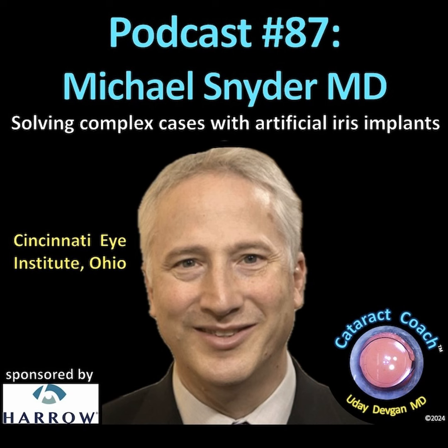And one of the other things that I'd love to get access to is some of the sulcus-based pseudophakic technologies, right? So there are actually some sulcus-based presbyopia correction options that are non-multifocal. Having access to some of the sulcus-based multifocality, where we can add multifocality to patients who have remorse about not having chosen it to start with, or add toricity or low power adjustments to pseudophakes who we don't have other great options for. Those are tools which our colleagues in Europe have right now that I'm hoping we'll get at some point in the not too distant future.